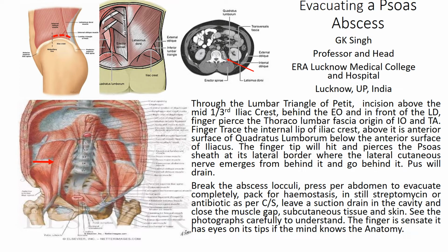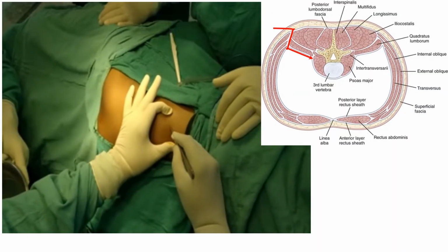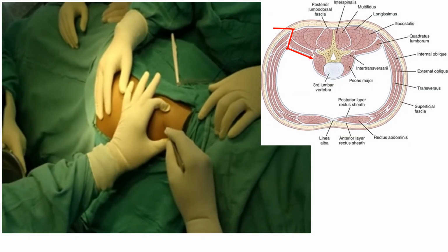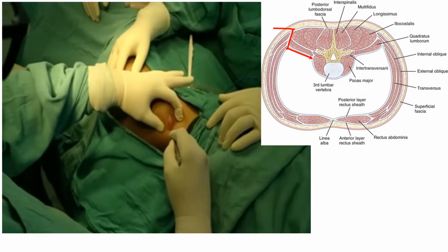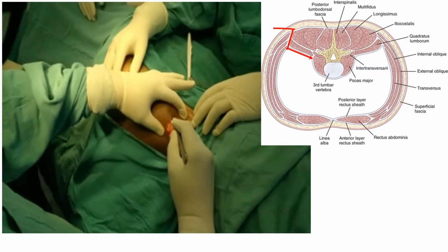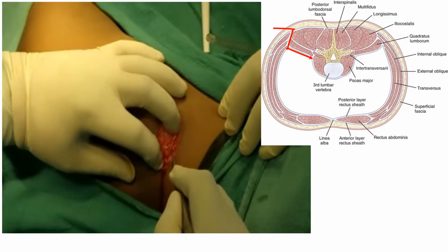Now you observe the operation. Ready? Yes, ready. Ready? Yes, ready. Retractor.